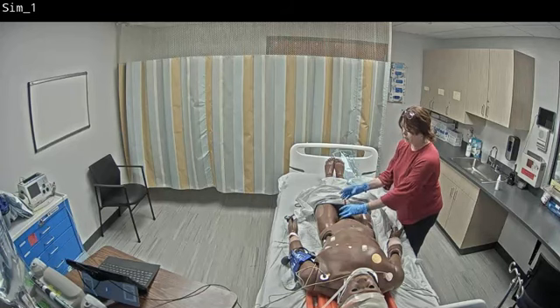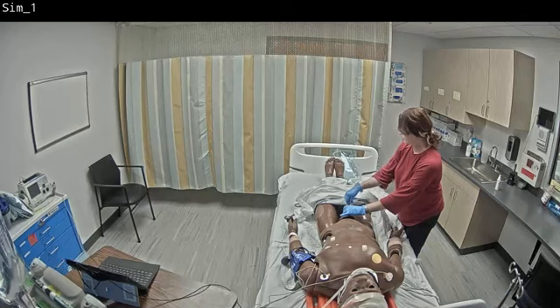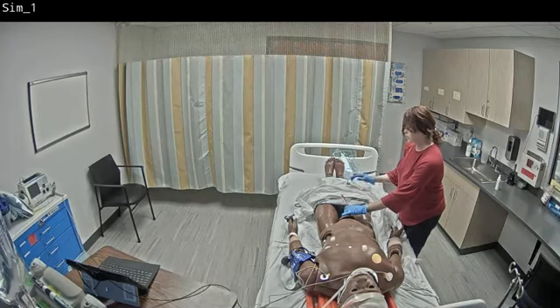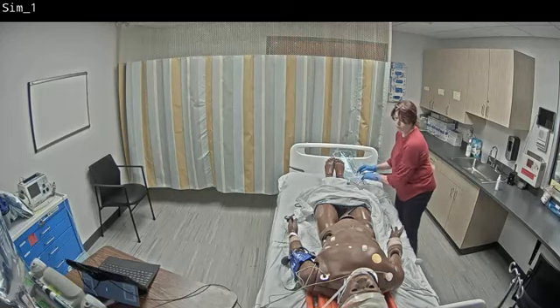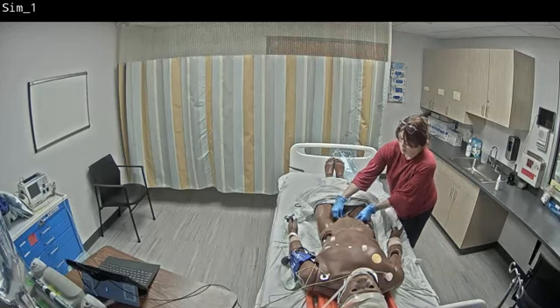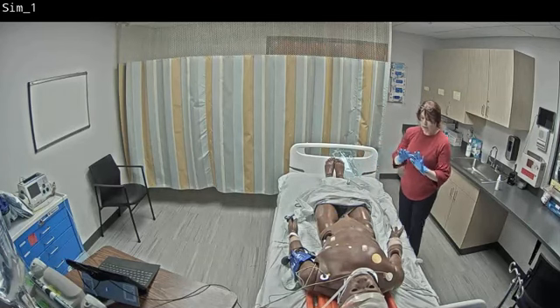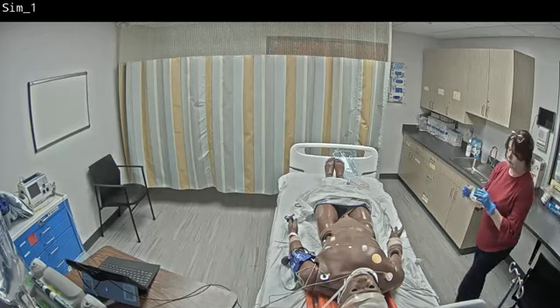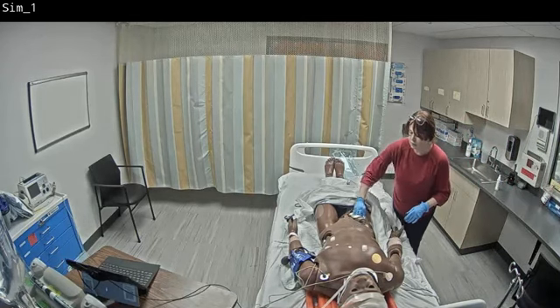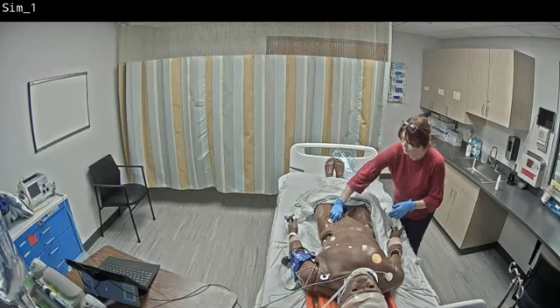So it will go all the way in, and if the bladder is prepped, you could have some output. So just make sure that your tray isn't under your simulator when you insert the Foley catheter. So that's pretty much it for how it will look with your simulator. I've got just a lot of mineral oil off of the simulator here.